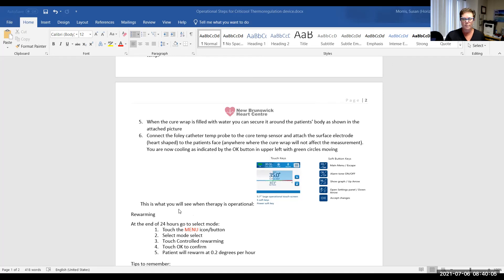When you want to rewarm the patient at the end of 24 hours, you're going to go up to that menu icon. You're going to go to select mode. You're going to hit control rewarming and then okay. And it will progressively increase your patient's temperature by 0.2 degrees per hour. Much simpler than our current process.